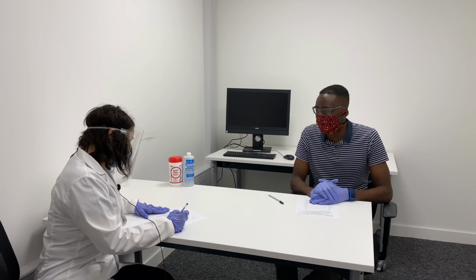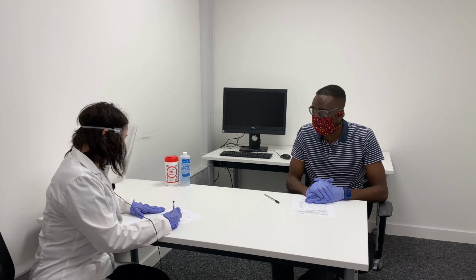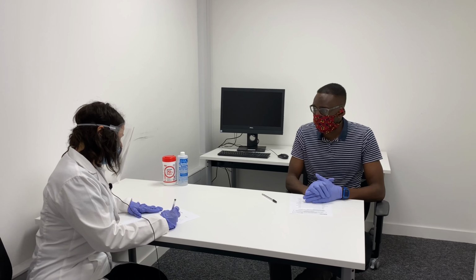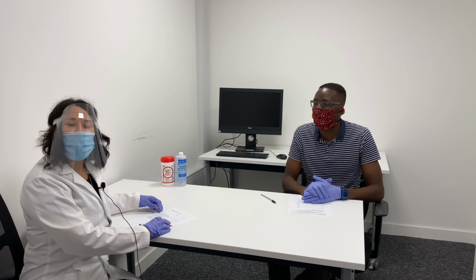Did you take any drinks with caffeine today? Yes, a coffee in the morning. When did you take the last drink with caffeine? 7 in the morning. These questions are important because caffeine and medication can have an effect on brain activity. So we have to control for these parameters.